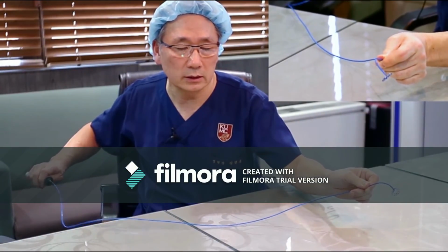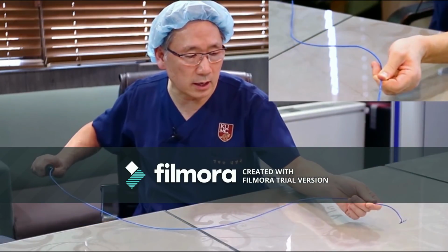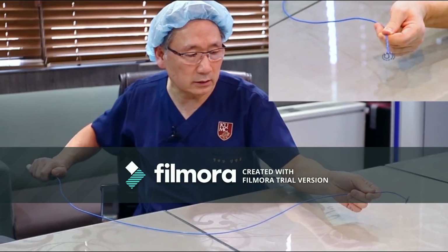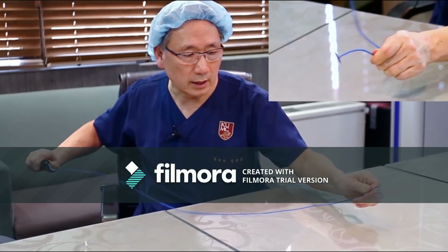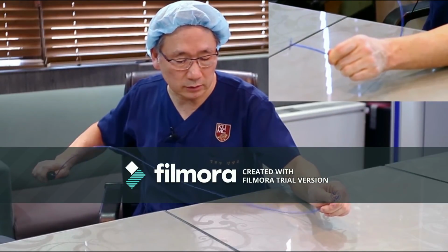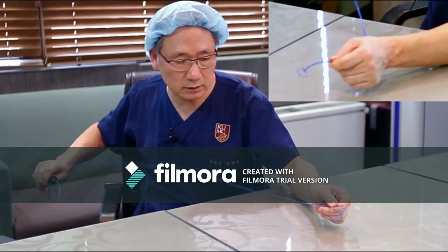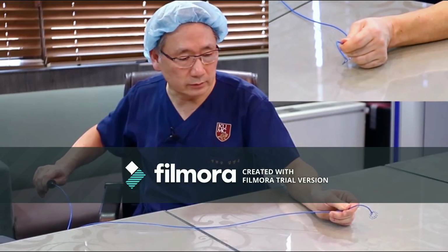That's another way. You can go from the RSPV and then counter-clockwise to the RI, but instead, in case of a difficult insertion, go to the LIPV, a little bit deflectable, and then clockwise. That usually goes into the RIPV.